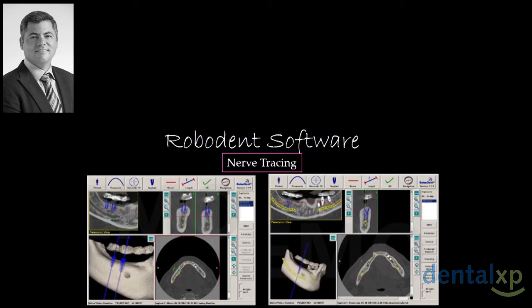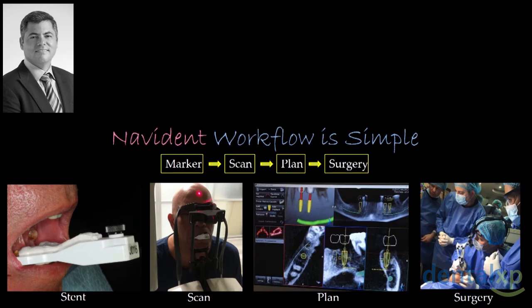And that is very impressive because many of us started to get exposed to computer-guided surgery and interactive software probably in 2004, 2005, 2007. And we thought that we were dealing with very, very new cutting-edge technology, and this thing has now been available for almost 2 decades. So interesting, that aspect of this technology.